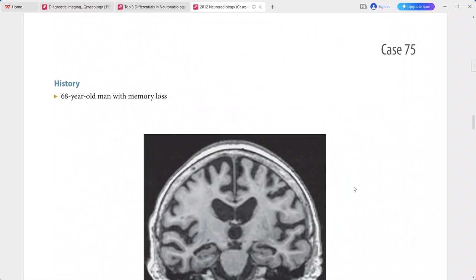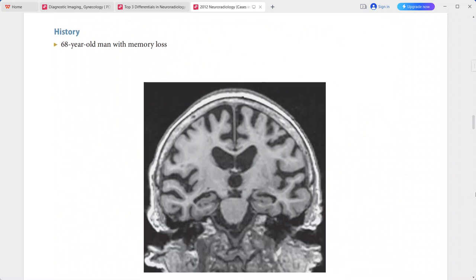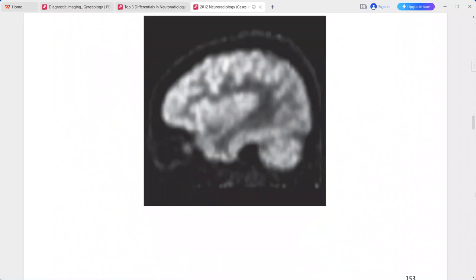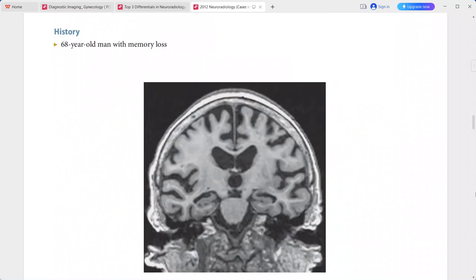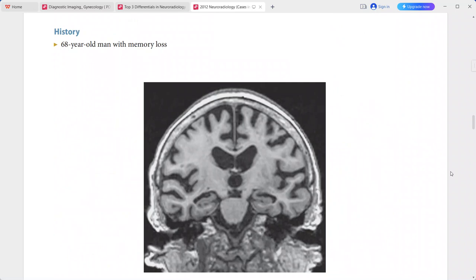Next is a 68-year-old man presenting with memory loss. On coronal T1-weighted MRI, there is bilateral hippocampal atrophy, which is proportionately greater than the diffuse cerebral atrophy also present.